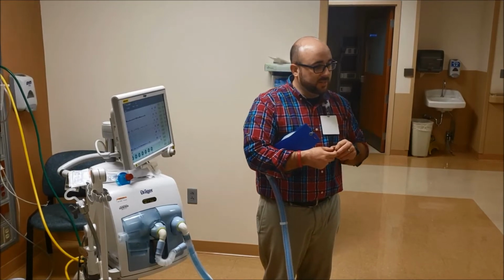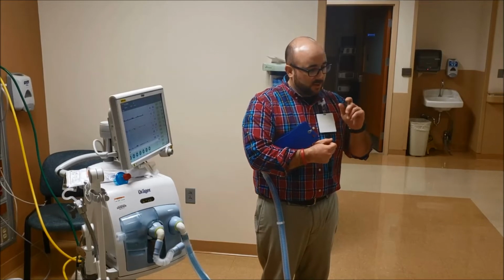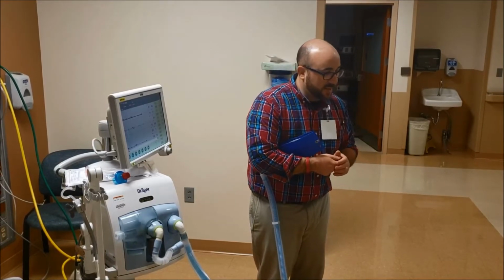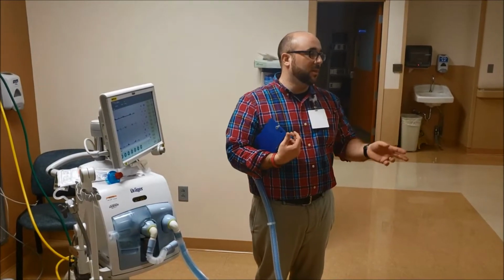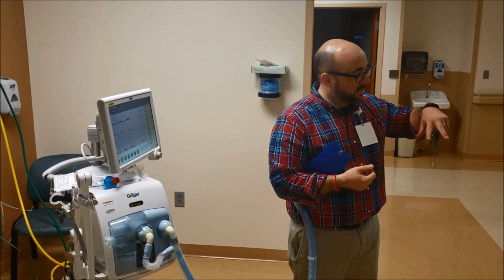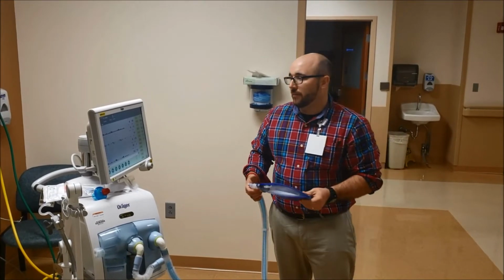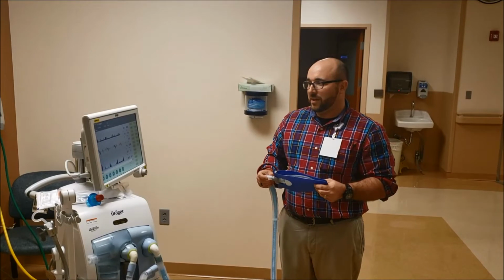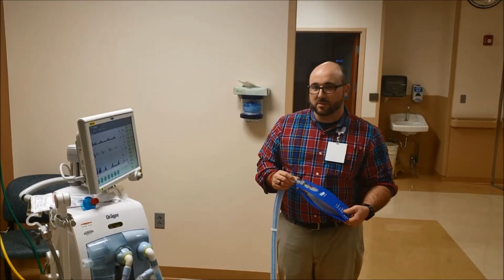So the best thing is you say, on 3, I want you to take a breath in. So there you go, 1, 2, take a breath in, and when you see them like this, deflate the cuff, pull it out, and then they cough. After you get the tube past the cords, then you tell them to cough. It's always taking a breath in because your vocal cords naturally open, and it doesn't rub as much. A lot of people have kind of fudged that over the years, but it definitely should be on inspiration when the tube's removed.